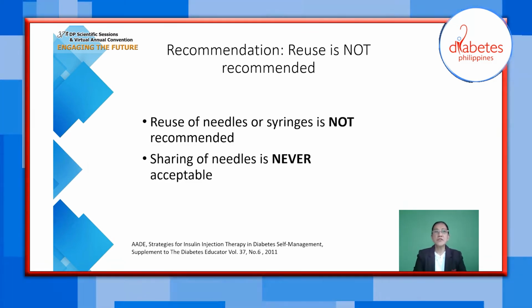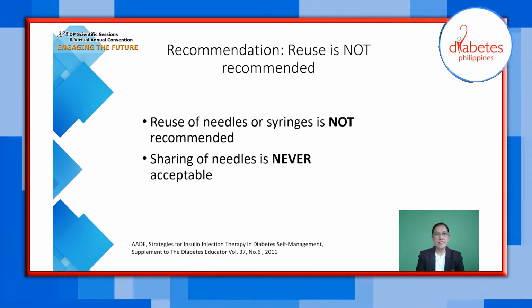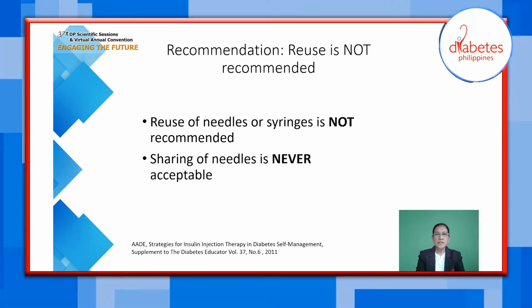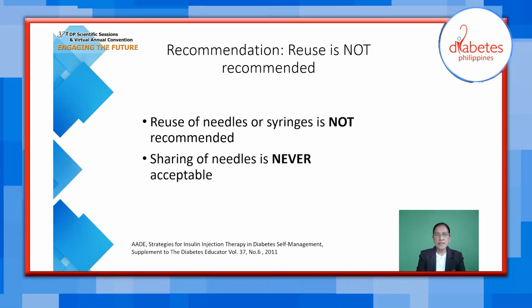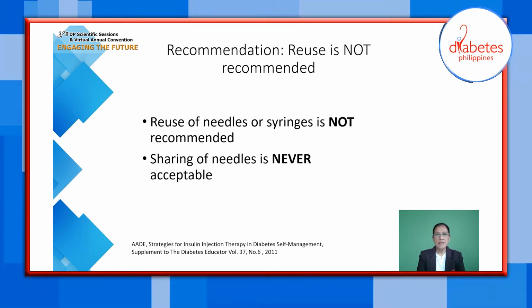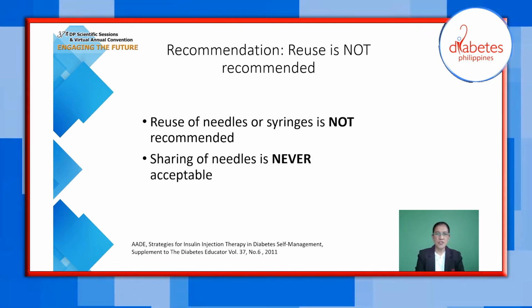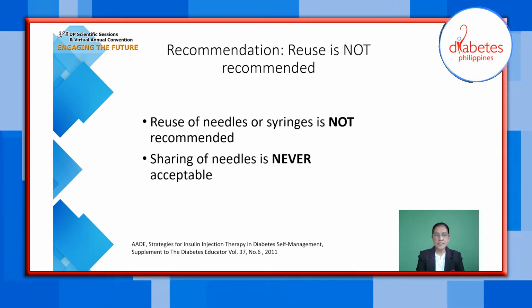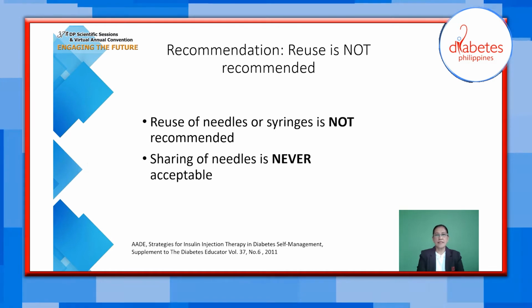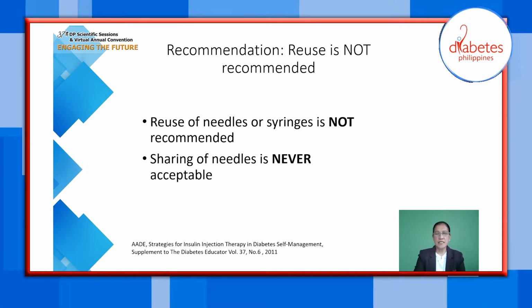Please never reuse your pen needle or your syringe. It is not recommended to reuse the pen needle or syringe. Sharing of needles is never acceptable. Please do not advise your patient to reuse your syringe and or pen needle. It's advisable, again, not to reuse needles.